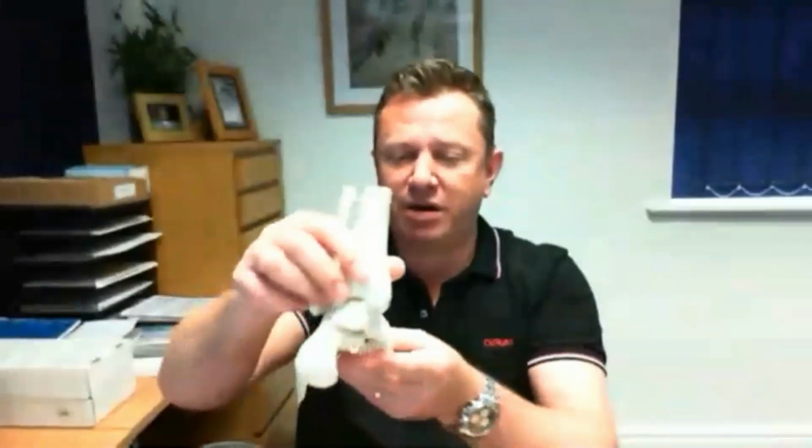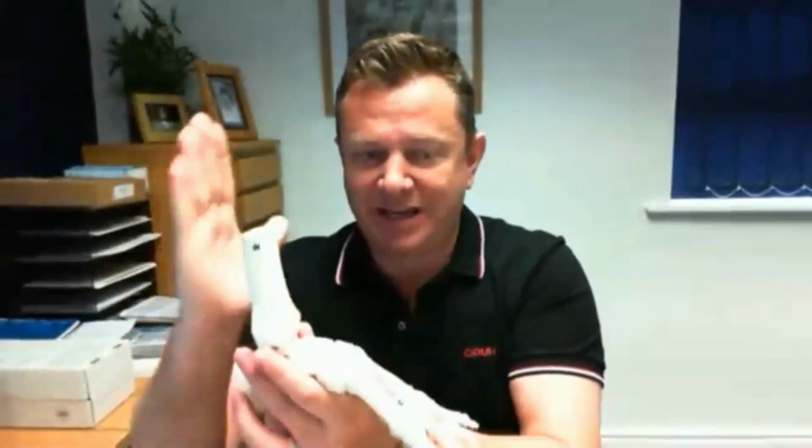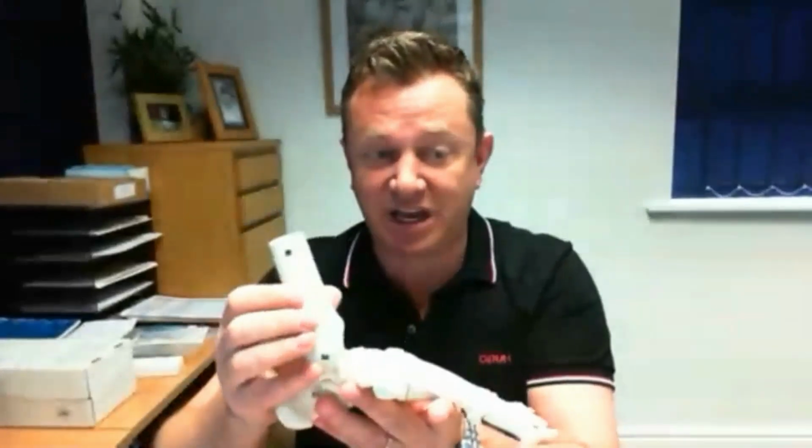If we're dealing with the pronating foot and we're dealing with a child with cerebral palsy or someone with gastroc spasticity, then we need to allow the ankle to have a functional range if we can. And there's loads of really smart ankle joints now. So Fior and Gentz have got one, Becker have got one, Otto Bock have got one. We're not talking about that today, but allow those patients to have a functional range rather than free motion.